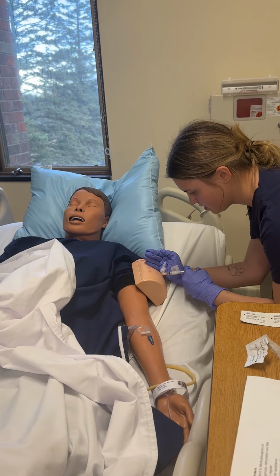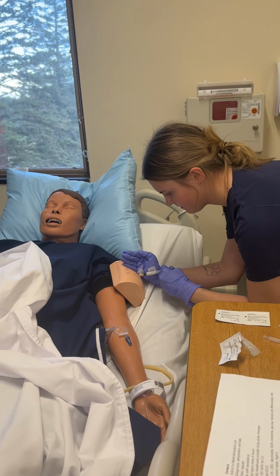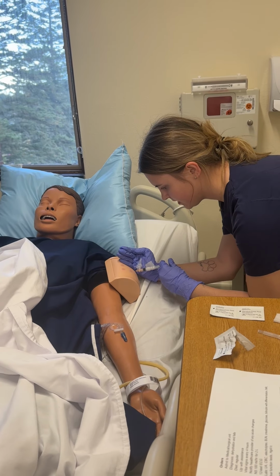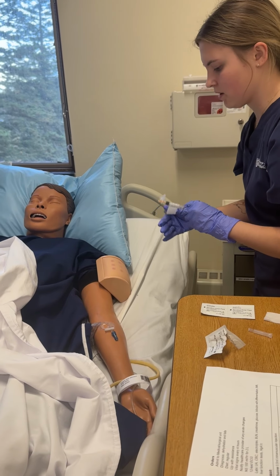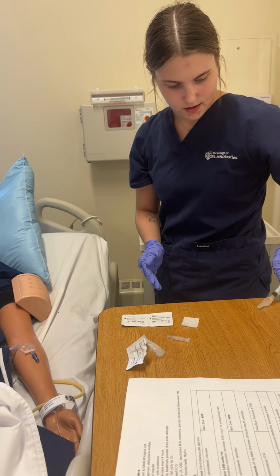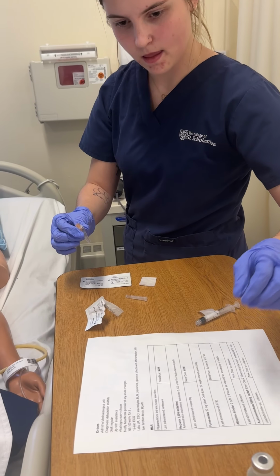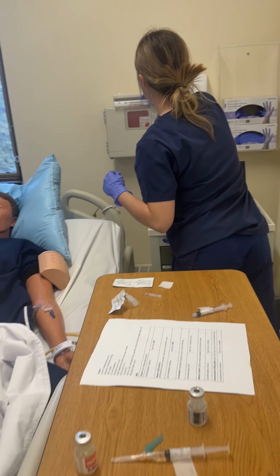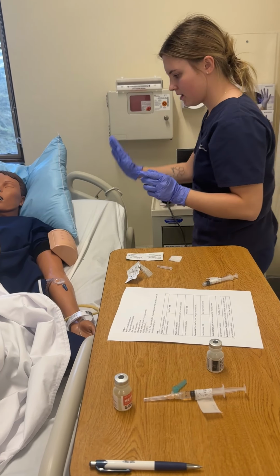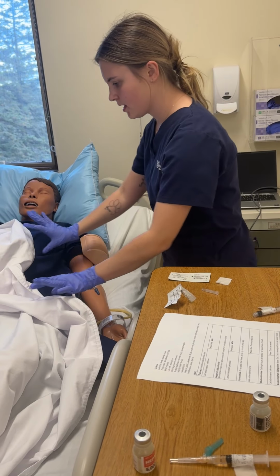Push in that medication. And pull it straight out. And then we're gonna put that skin back over. And we're gonna close that. And we are gonna put our needles in the sharps. And we would put a Band-Aid over the injection site.